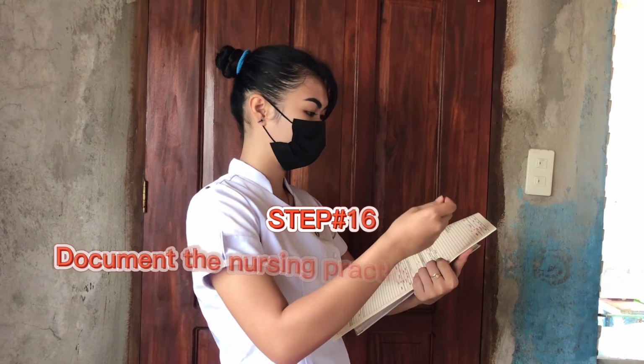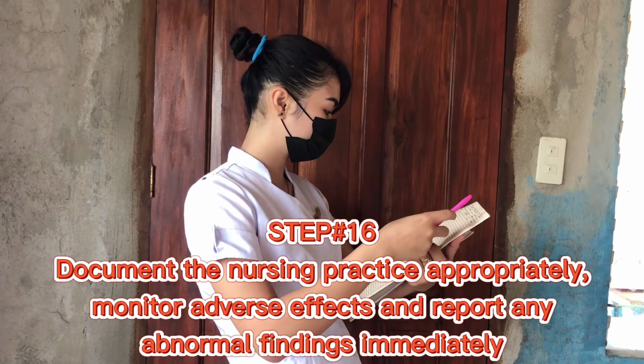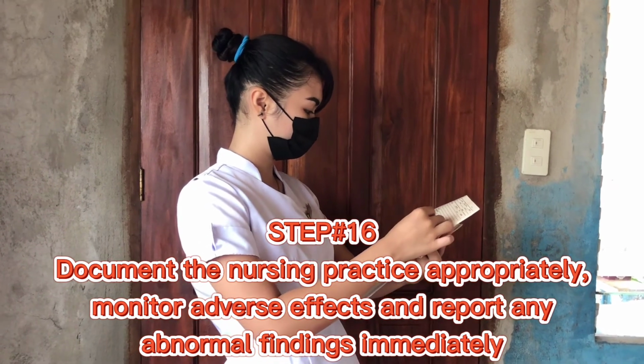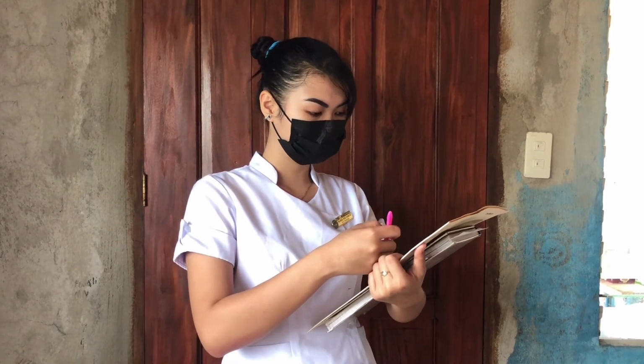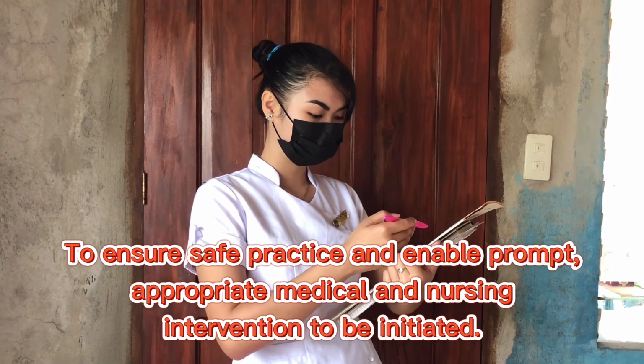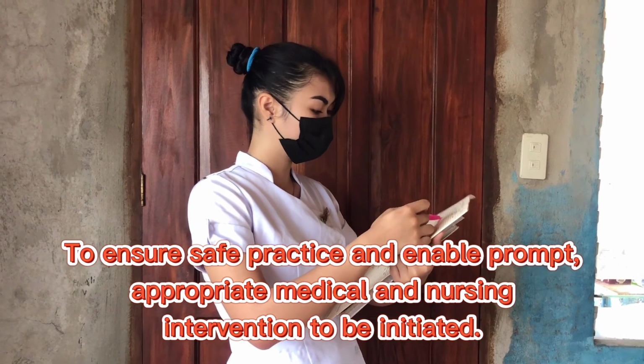Step number 16. Document the nursing practice appropriately. Monitor adverse effects and report any abnormal findings immediately. This is to ensure safe practice and enable prompt, appropriate medical and nursing intervention to be initiated.